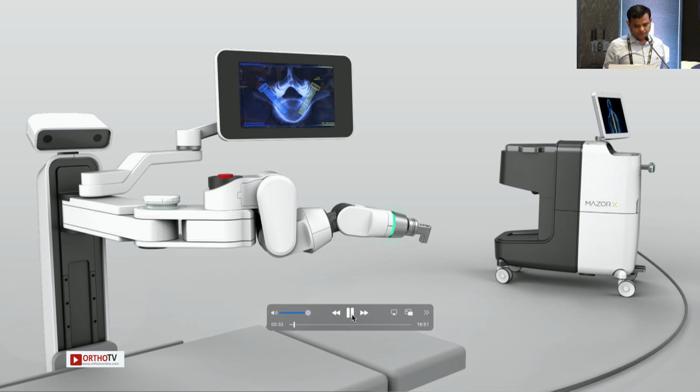Okay, and that's the robot which we are using. That's the Mazor one. That's the robotic arm, and this is the guide for the pedicle screws. That's the emergency switch. That frees the robotic arm movements, so you can manually move the arm, and once you lock it, the robot arm moves only when you give a command through the software. That's the screen for the surgeon. This is draped and sterile. You can control, plan, and navigate through this screen.